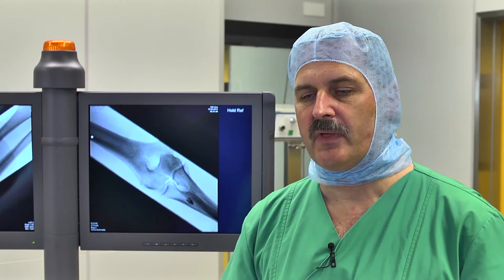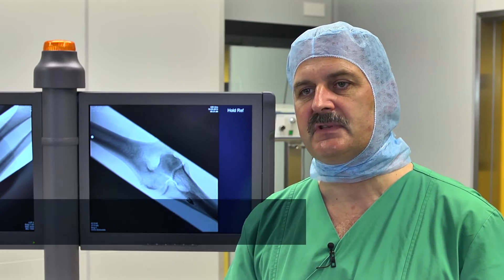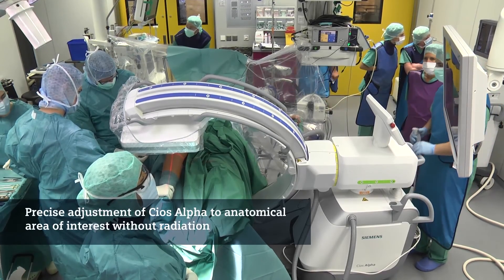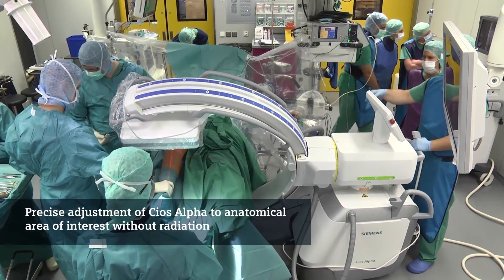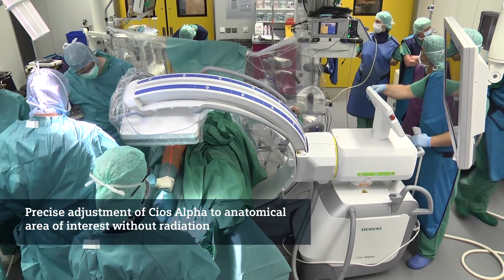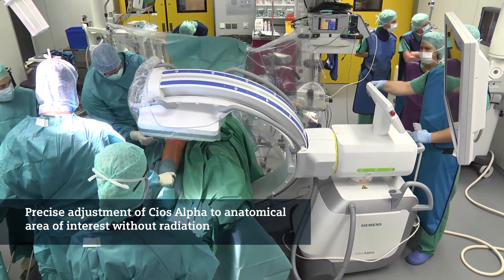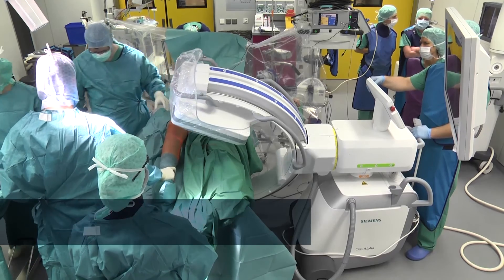By using the motorization I can very precisely control the movement of the system, and using the laser crosshair I can precisely adjust the system to my anatomical area of interest.